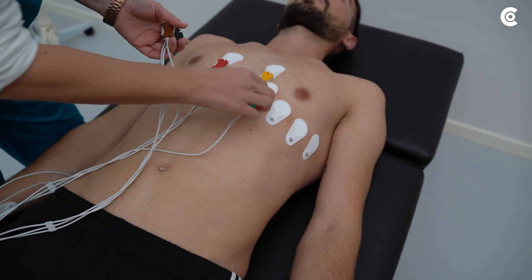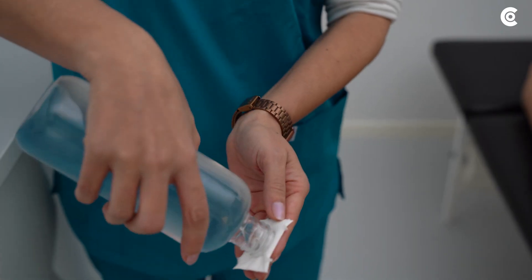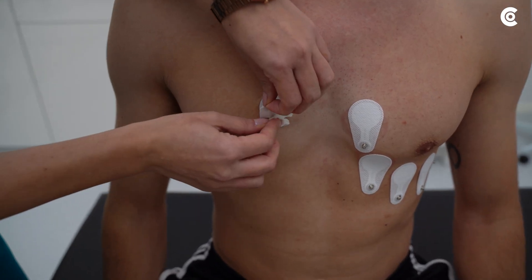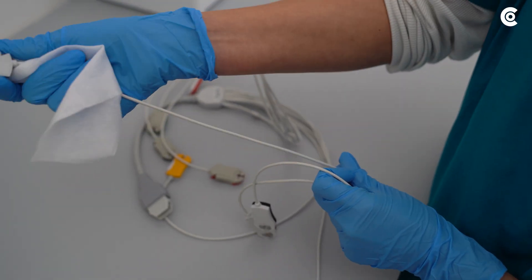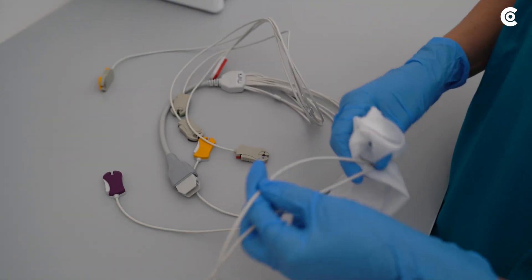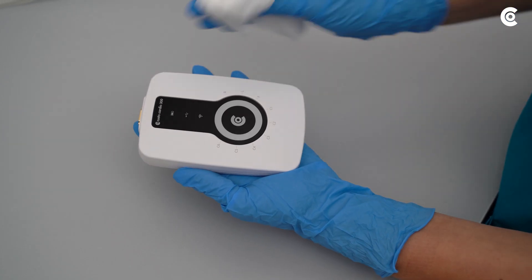If you have performed the ECG with Cardio 300, remove the electrodes from the patient and dispose of them. Finally, disinfect the ECG cables, the clips, and the device by means of wipe disinfection.